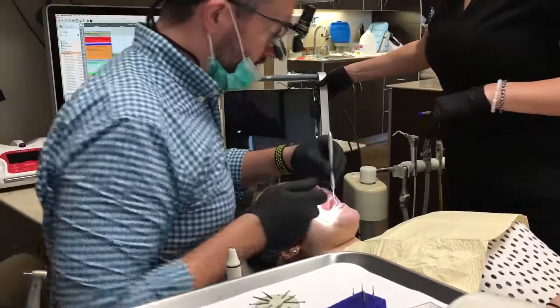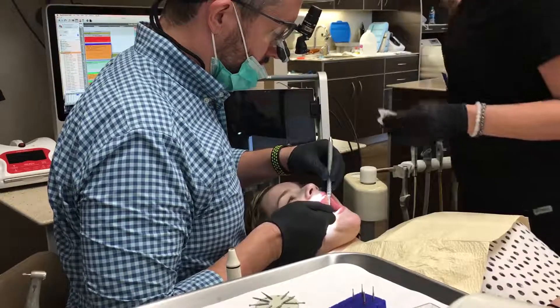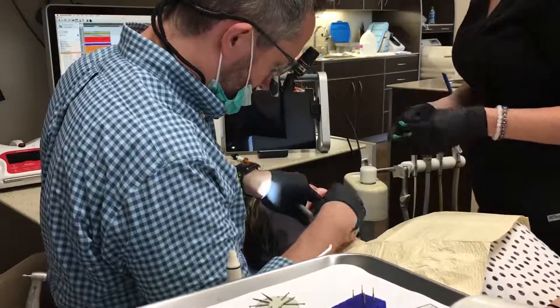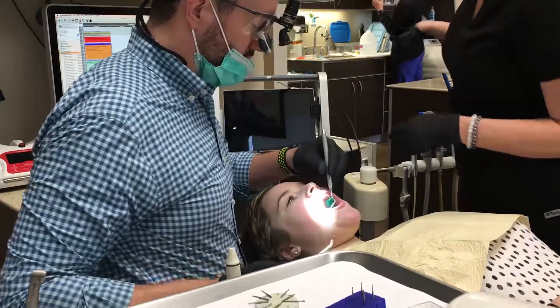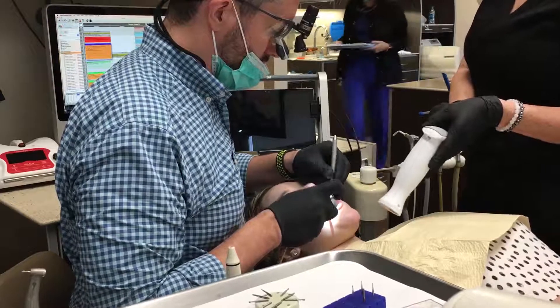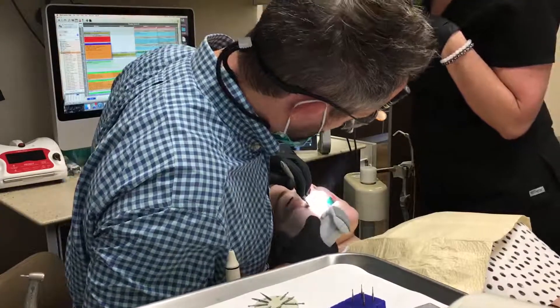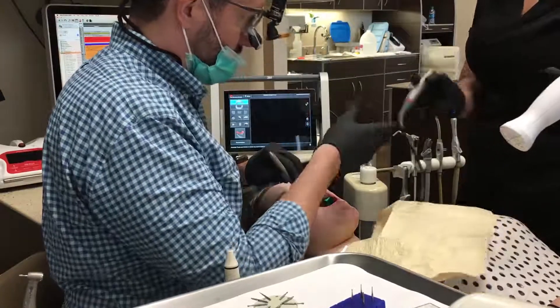The first step in any scanning procedure with the 3M True Definition Mobile Scanner is to isolate the area. I generally will use a dry angle over the parotid papilla and cotton rolls to achieve that. A lot of times I'll use a bite block as well. Once that's in place and we have everything isolated, we dry everything really well. Then we're going to use this little gun to do a light dusting of powder. This isn't like the big snow drifts of powder from the old Red Cam days — just a very light dusting that takes a couple of seconds.